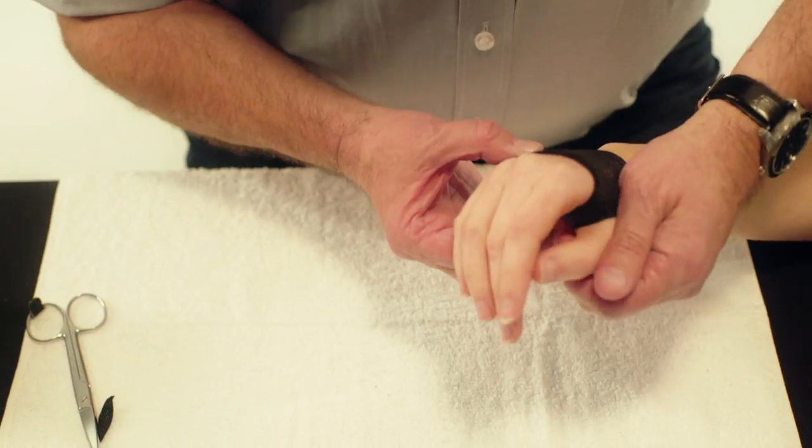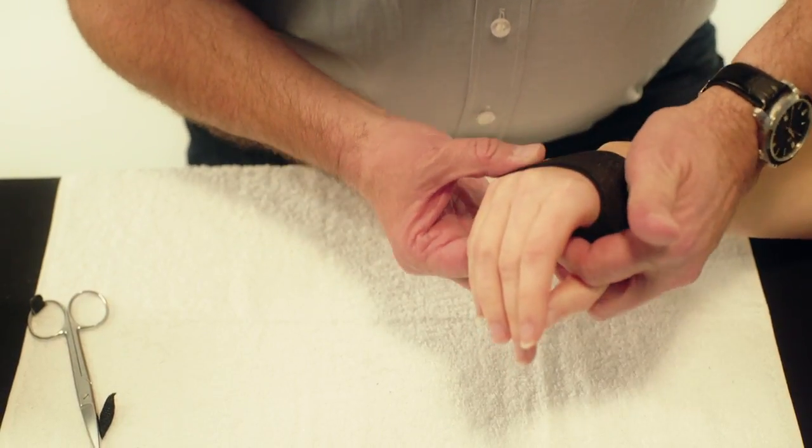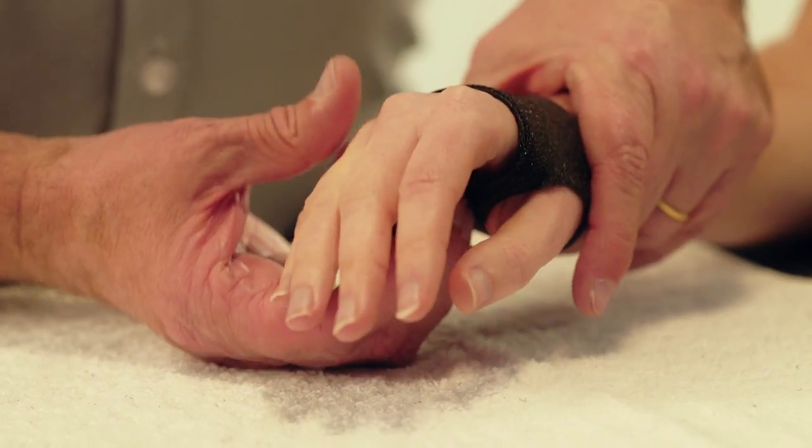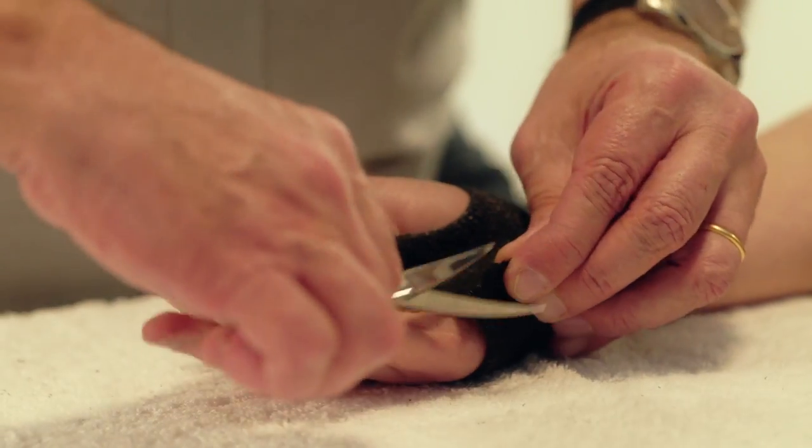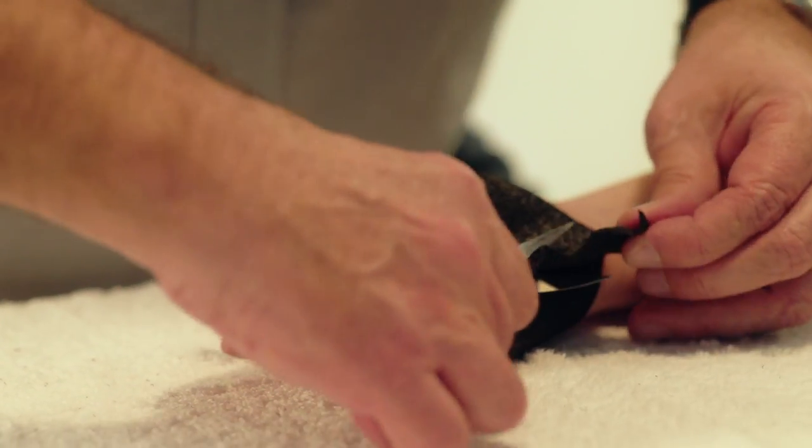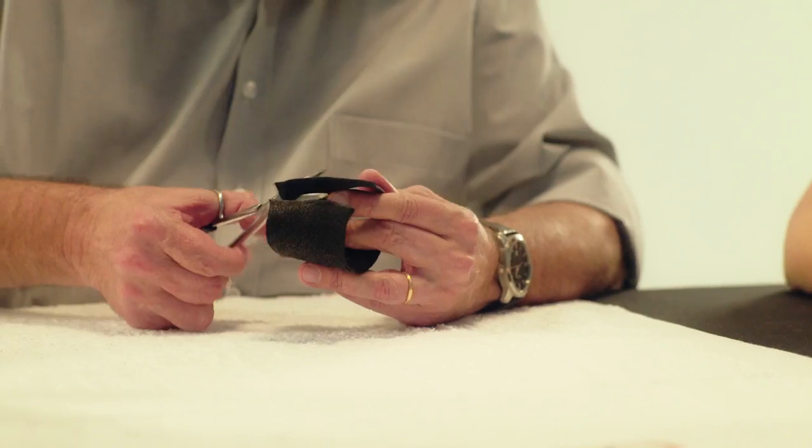Carefully mold the palmar arches. Cut the orthosis across the palmar side and round the edges.